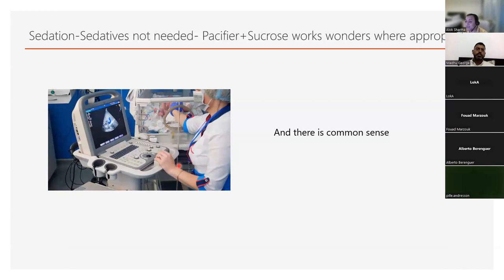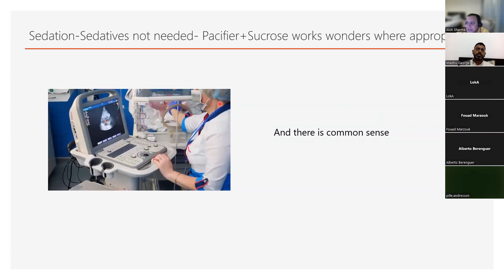So sedatives are not necessary for big term babies, near term babies, or for the preterm babies who are not ventilated, where it's safe, use sucrose. For the bigger babies who can suck, use a pacifier. Use common sense. Have somebody who's going to help you do these scans.